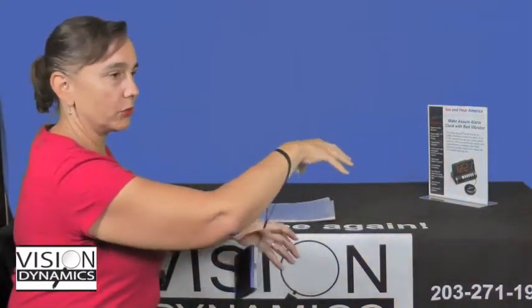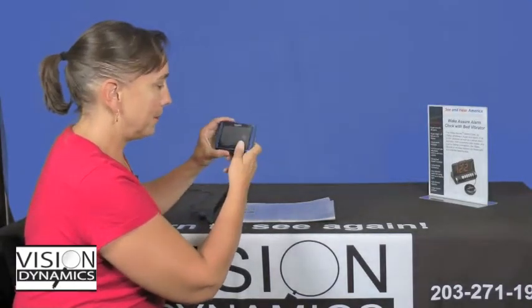Using it to look at price tags. If you drop it, it's right there. You haven't let it hit the floor. It's safe. So use the wristlet as often as you can. I'm going to take it off for the moment, though, so I can move around and show you the buttons.